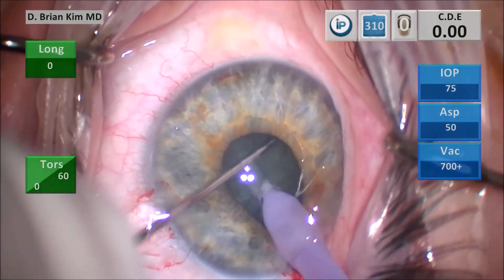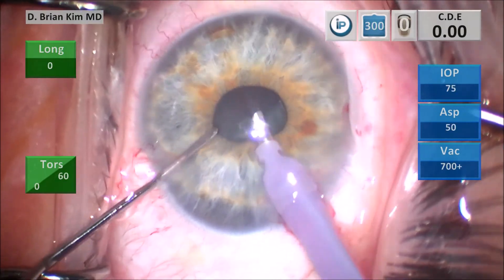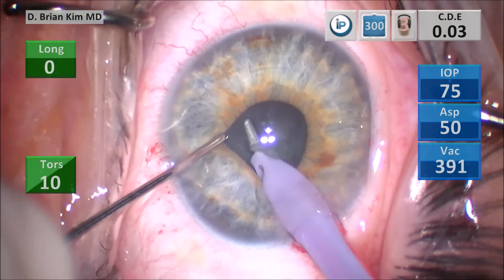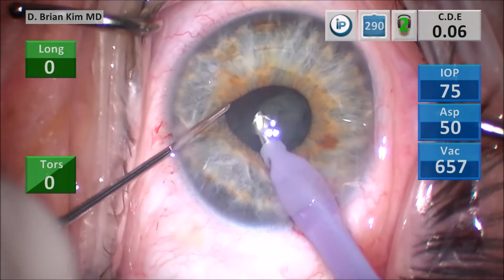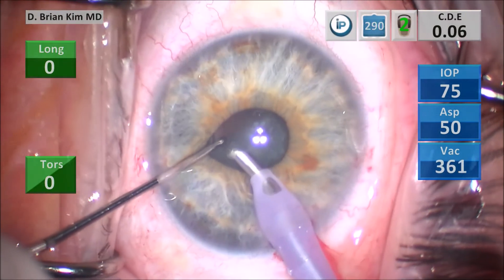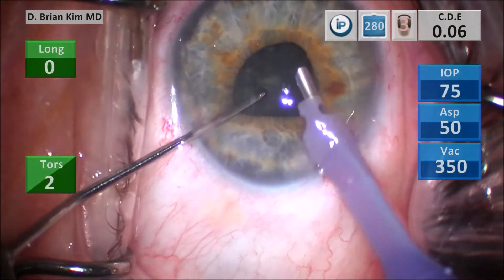I'm going to go ahead and try to grab that piece in front of me. You can see how floppy this iris is and how it's really moving around. This is the last case I'll be showing you. You want to bring the lens material into the center. This is a very soft lens and it's kind of cheese-wiring through as I'm trying to grab it — it's a very sticky lens, so this is really the most challenging of the cases shown. Make sure the chopper keeps the iris away, and use the chopper to hook and pull the lens material into the central safe zone, then emulsify the lens pieces as they come.